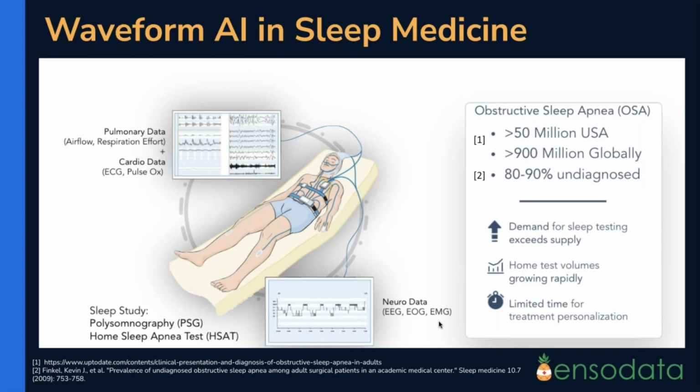Now, throughout the years, we've just seen the demand for sleep testing go up and up. We are really in a situation where the demand exceeds the supply. And also, because this whole scoring process can be very time consuming, you can imagine that this can really limit the time that the sleep physicians or other clinicians can spend with their patients and create a more personalized treatment plan.